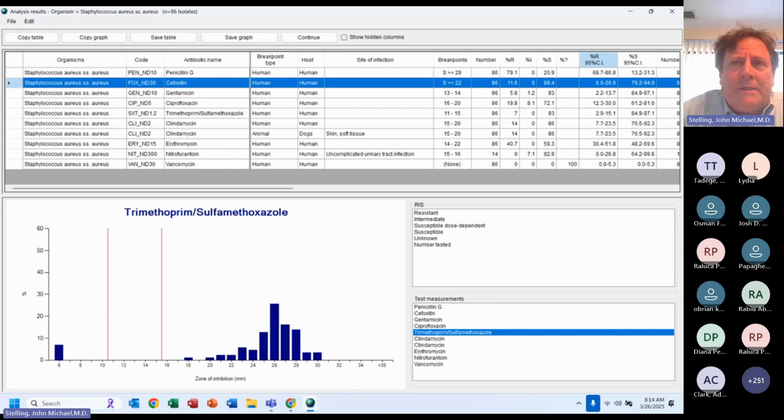So when the laboratory reports susceptible, it doesn't mean the bacteria does not have a resistance gene. There are resistance genes that are very weak. There's a little bit of a change in the zone diameter, a little bit smaller, but the patient will still get better, based on pharmacokinetic data, pharmacodynamic data, the dosing that's utilized, animal models, and previous human experience.